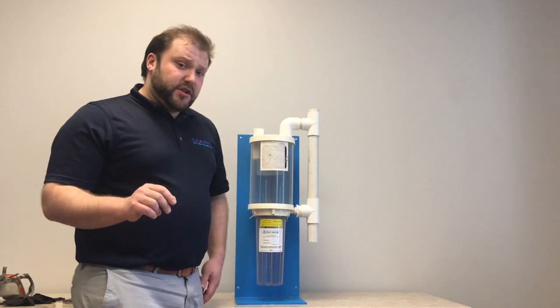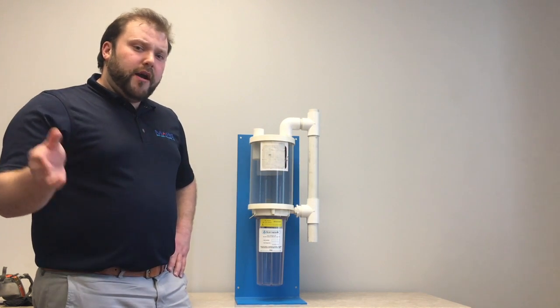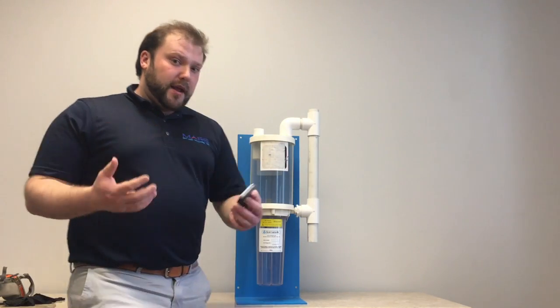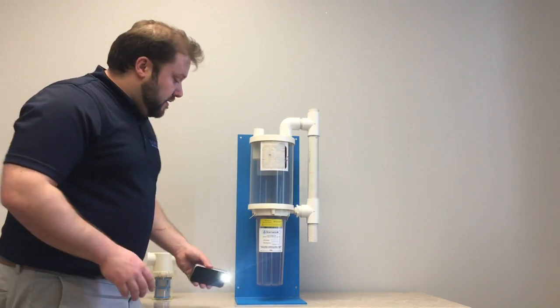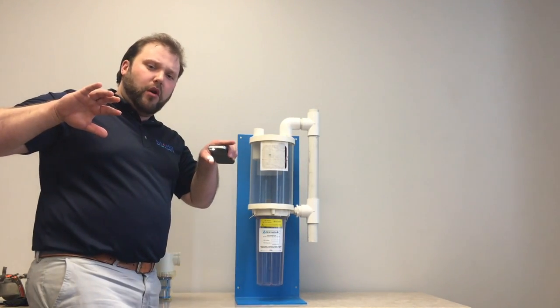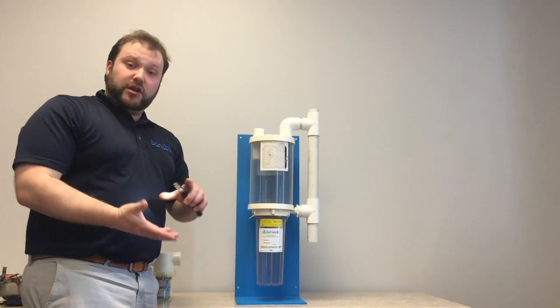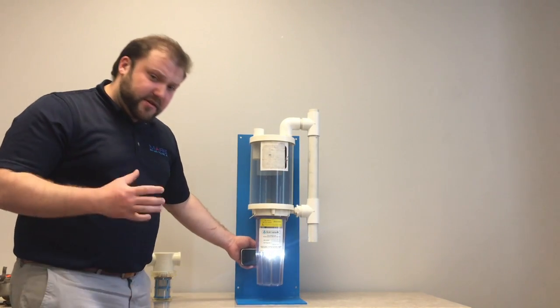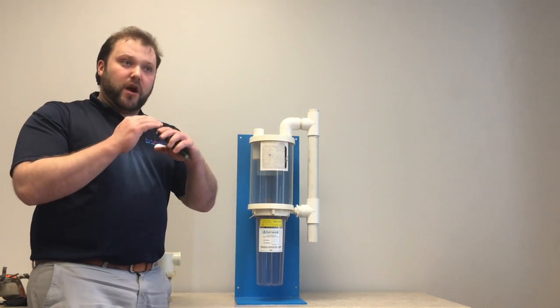The first thing I want to suggest is that pages 5 and 4 of the SolmeteX manual require a weekly maintenance of this system. What I like to do is take my cell phone, and what they suggest is take a flashlight and shine this against the filter. Use multiple sections. As sludge builds up on the side walls, it's hard to determine if it's just buildup on the walls or actual fillage. So what I do is I look in a couple of sections until you see light. Once you see light and you move it around and you see light in a few sections, this will give you an indication of where the sludge level is.